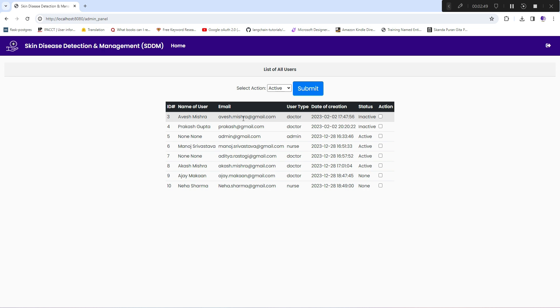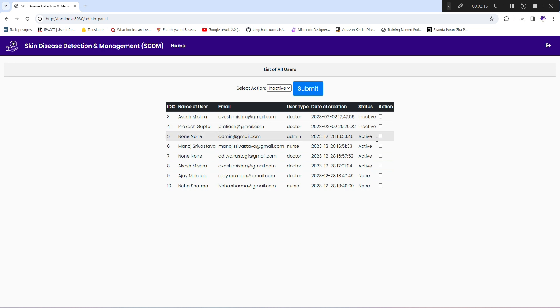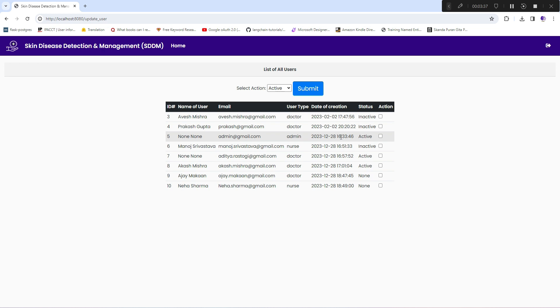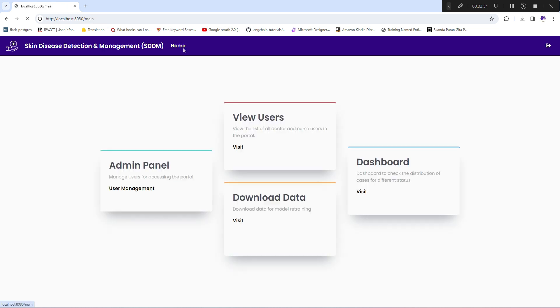Clicking on the admin panel shows all doctors, admins, and nurses — this is the complete user management screen. You can click a checkbox to make any user inactive. For example, if a doctor is no longer associated with your hospital, you can make them inactive. Similarly, you can inactivate an admin who is no longer working with your system and then create another admin.